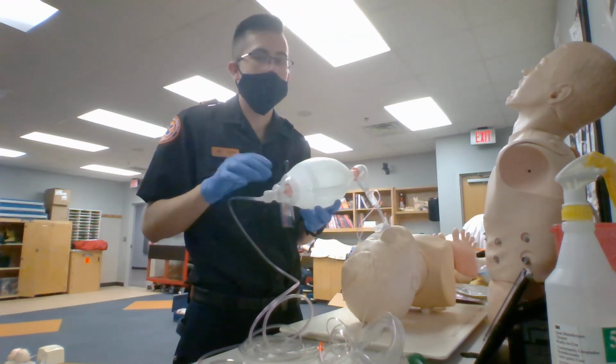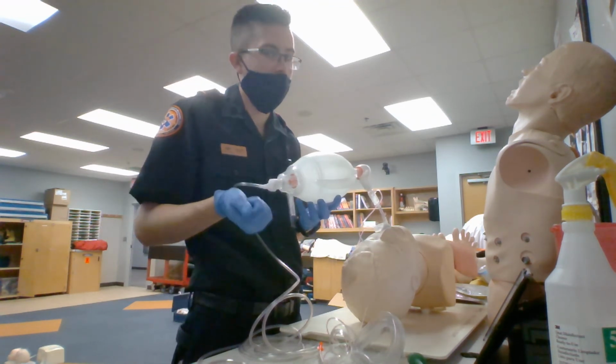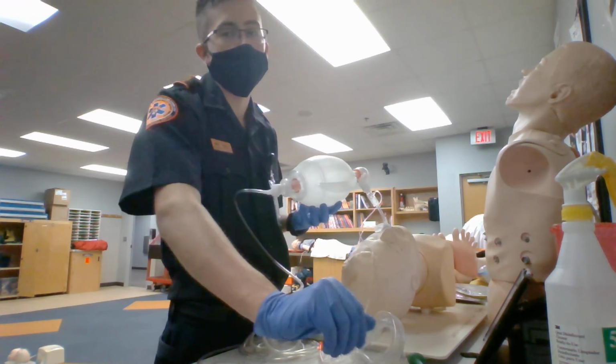and then continue to ventilate my patient at a rate of 10 to 12 times a minute, assessing for any changes in patient condition as well as SpO2, capnography, hypoxia, and then monitor my patient while en route to the hospital for any change in patient condition.